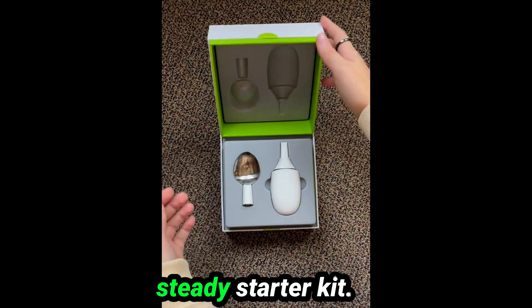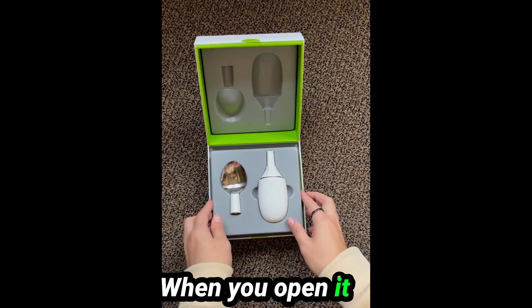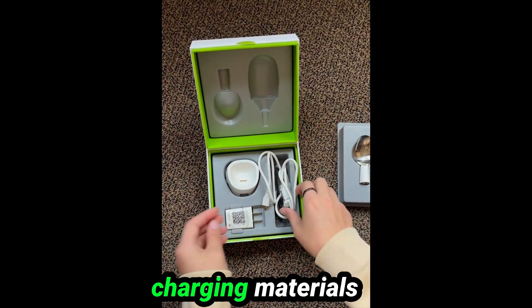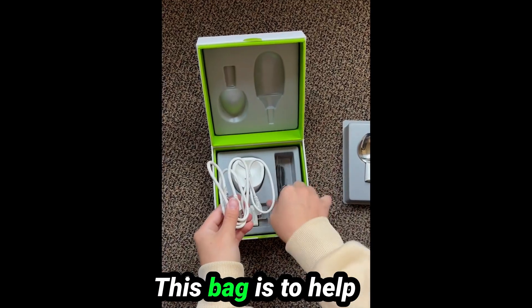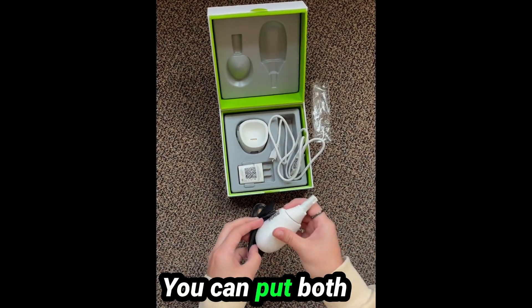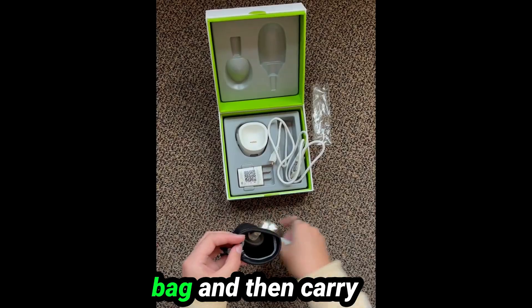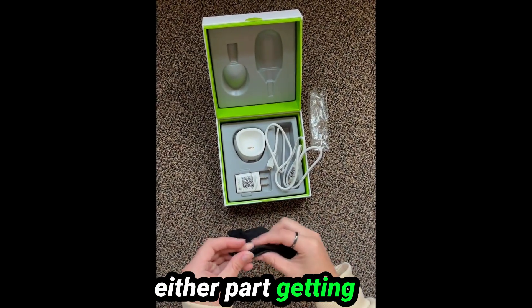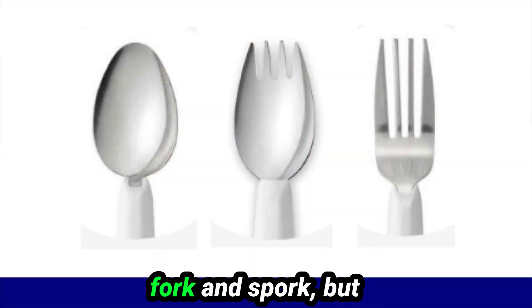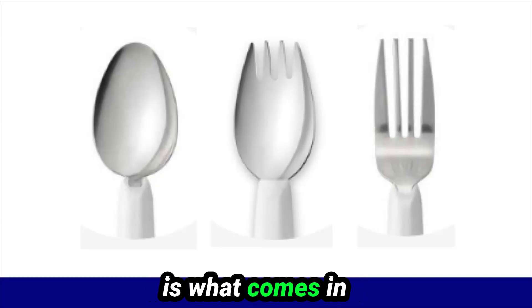This is the Liftware Steady starter kit. When you open it up, you will see the handle and the soup spoon attachment. Under that, you will find all the charging materials and a small bag. This bag is to help make transporting the Liftware Steady silverware easier. You can put both the handle and the attachment in the bag and carry it around without either part getting dirty or lost. You can get other attachments like the everyday spoon, fork, and spork, but the soup spoon is what comes in the starter kit.